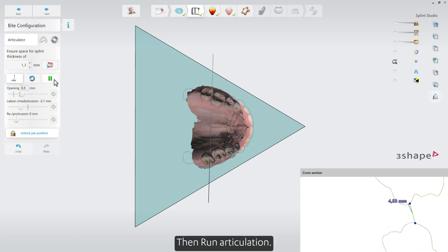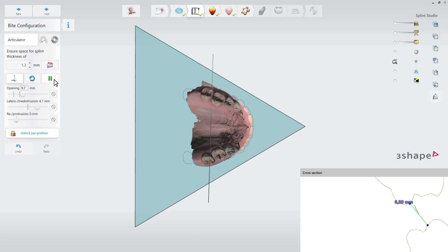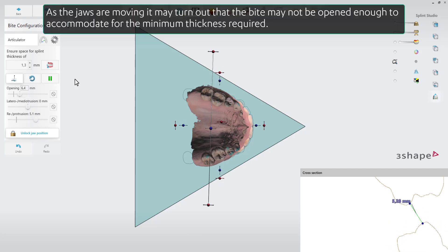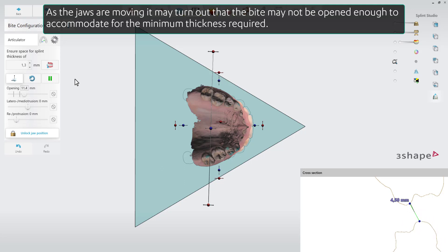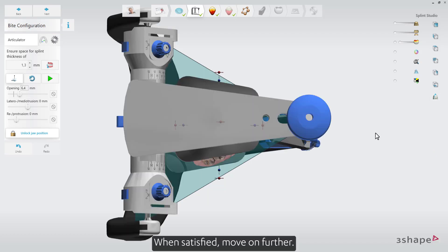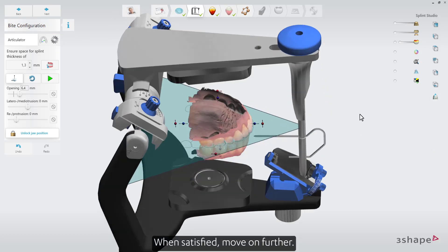Then run Articulation. As the jaws are moving, it may turn out that the bite may not be opened enough to accommodate for the minimum thickness required. When satisfied, move on further.